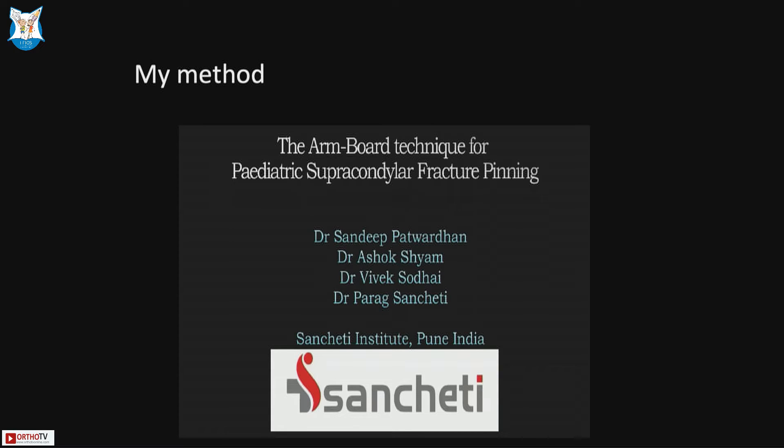We will play a short video presenting our armboard technique for closed reduction and pinning of supracondylar fractures in children.